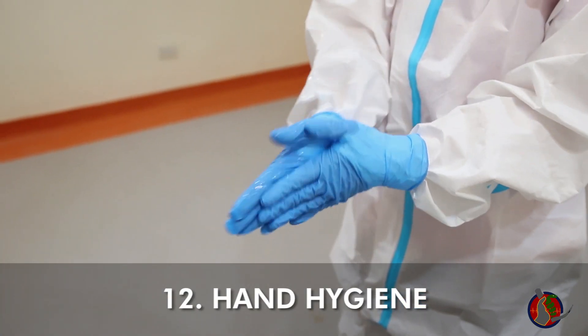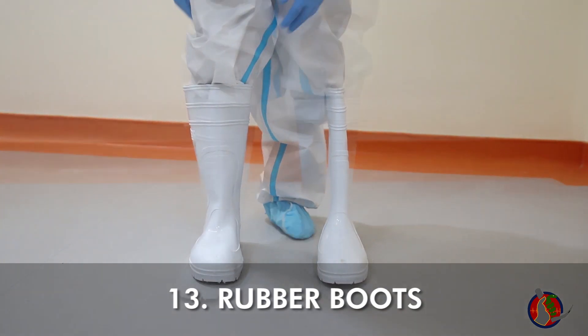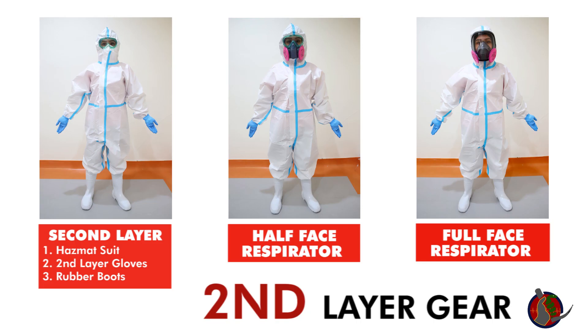Do hand hygiene. Slip into rubber boots. You have now donned your second layer gear.